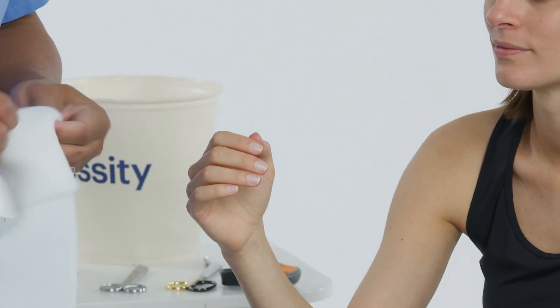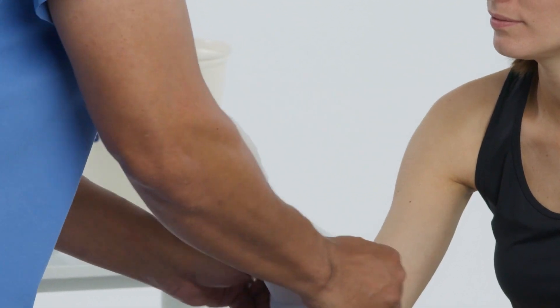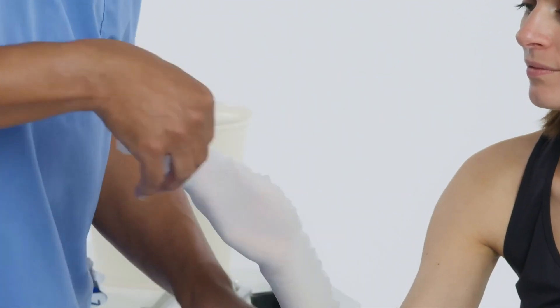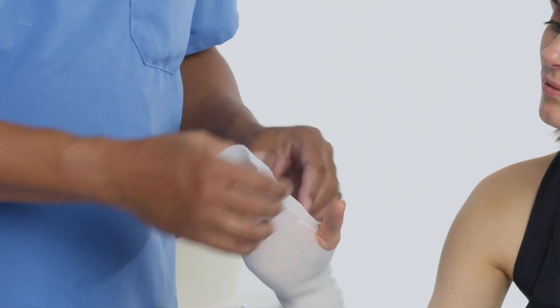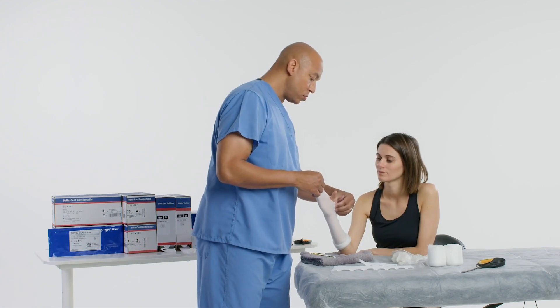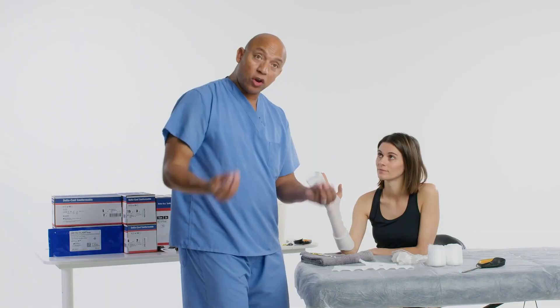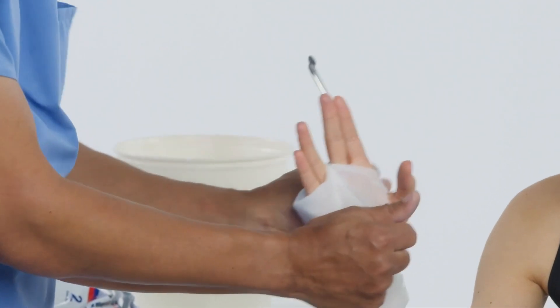Let's apply the stockinette. I'm going to cut a little hole at the base of the thumb, and then cut a hole for the index finger and long finger. We have the holes cut for the injured side. I'll cut this and lay it down, or envelope it over the cast when it's time to finish the cast off. I'll cut two little slits to make sure it folds down pretty well.